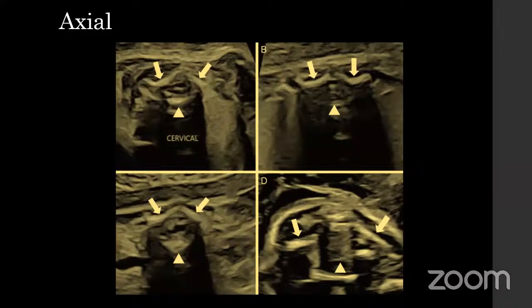Very important to look for cord splitting in diastematomyelia in the axial section. And another important use is in cases of chondrodysplasia punctata, where you look for splitting of the vertebra, the vertebral processes. That is very important in cases of chondrodysplasia punctata. And even in case of diastematomyelia, you find an echogenic mass. You want to rule out cord splitting. This is the section you have to run down to look for the actual level of the cord splitting.